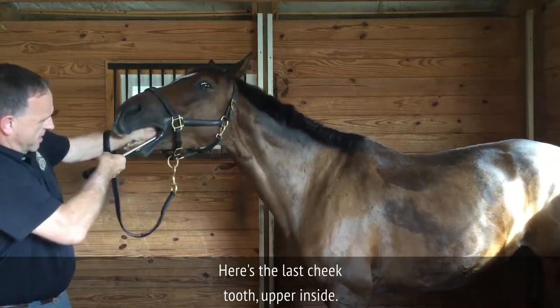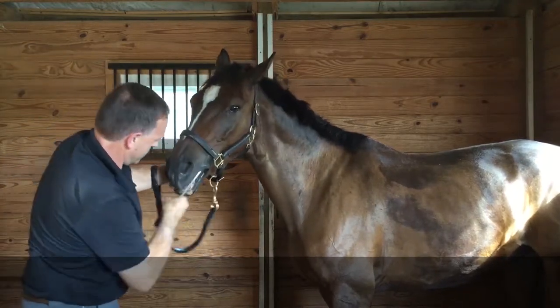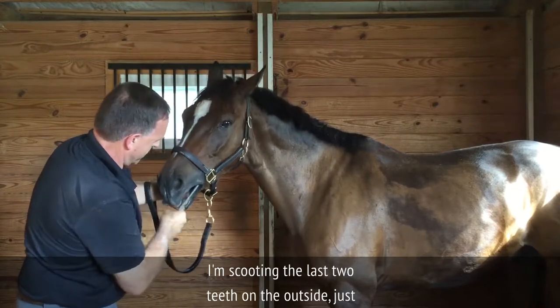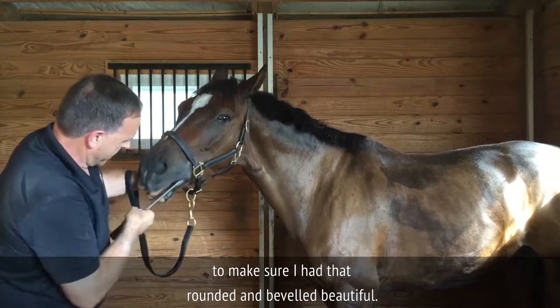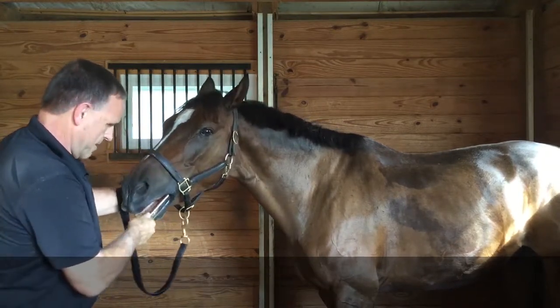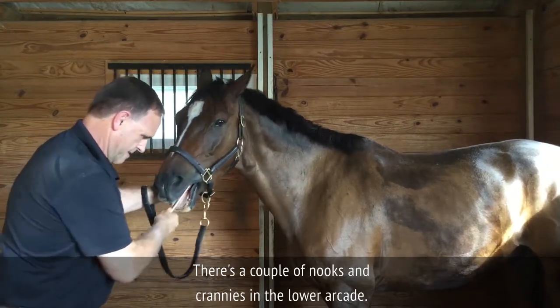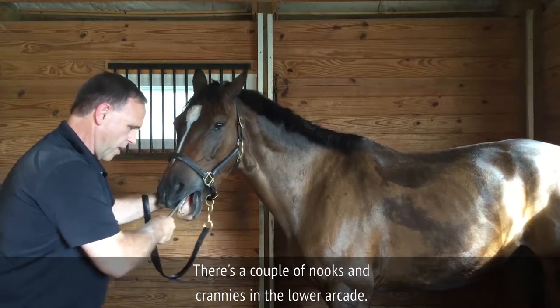There's a couple of edges on the palatal side that I've not addressed yet. Here's the last cheek tooth, upper inside. I'm scooting the last two teeth on the upper outside — just make sure I have that rounded and beveled beautifully. There's a couple of nooks and crannies in the lower arcade.